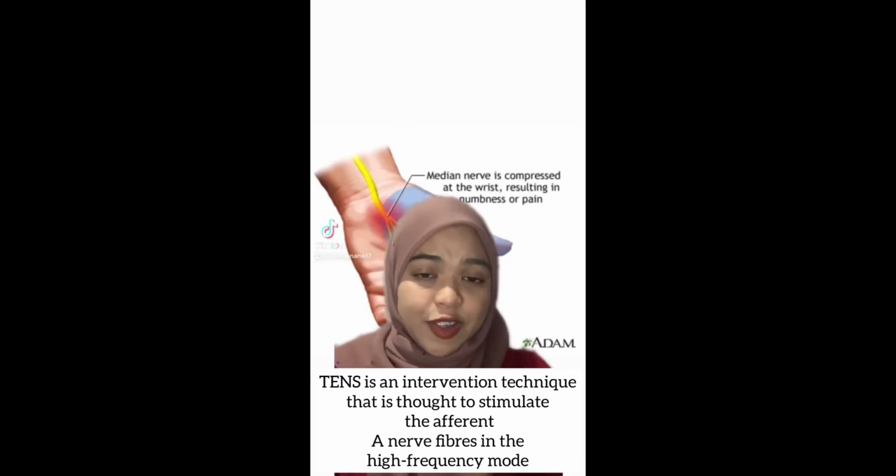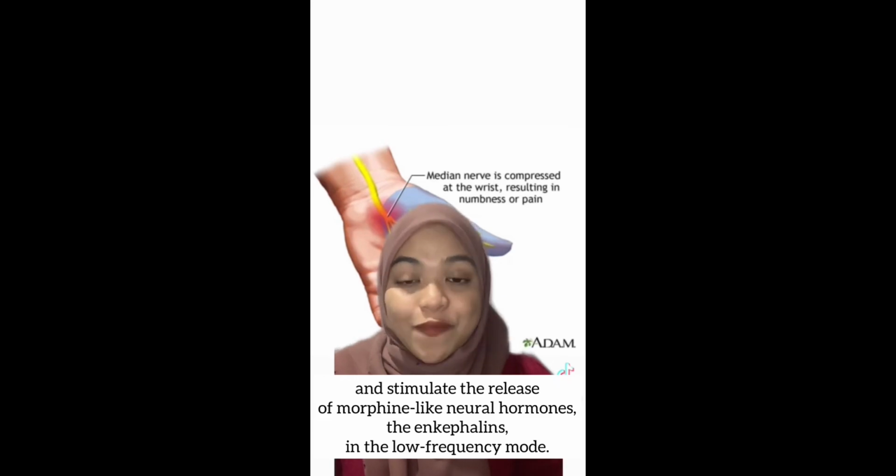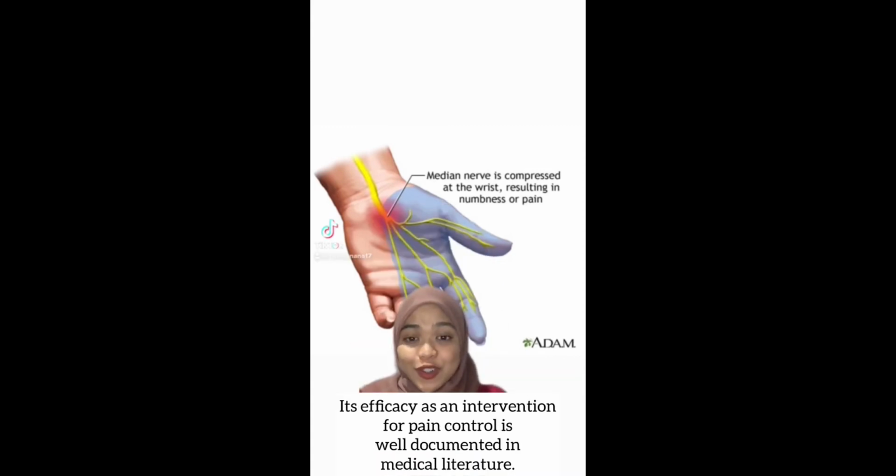TENS is an intervention technique that is thought to stimulate the afferent A nerve fibers in the high frequency mode and stimulate the release of morphine-like neural hormones, the enkephalins, in the low frequency mode. Its efficacy as an intervention for pain control is well documented in medical literature.